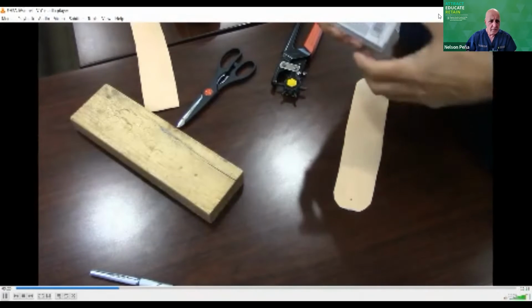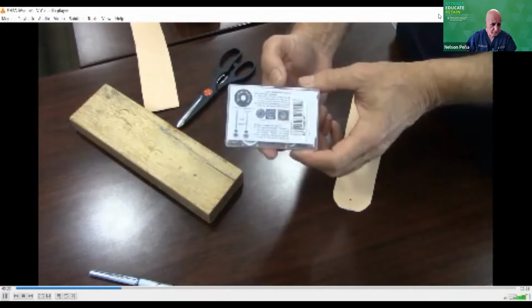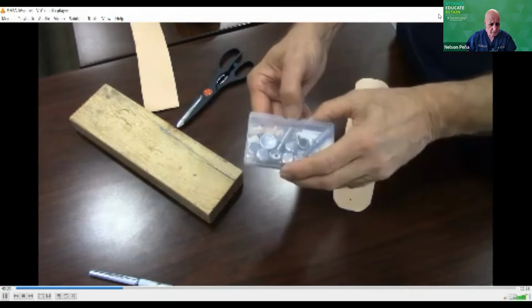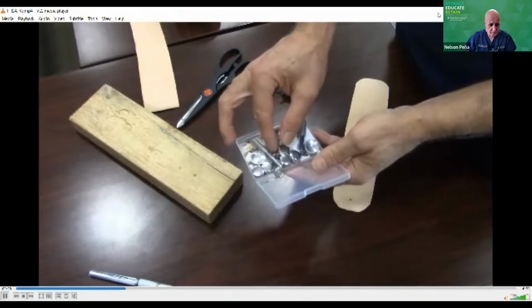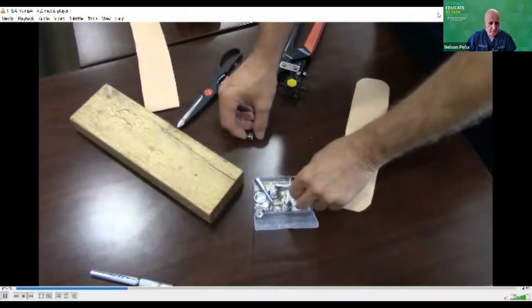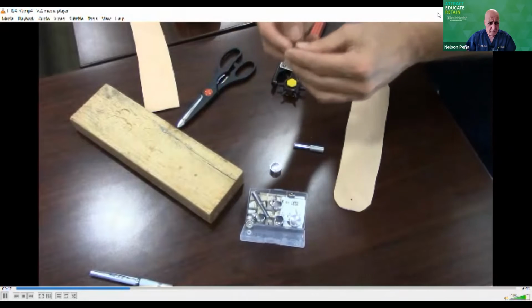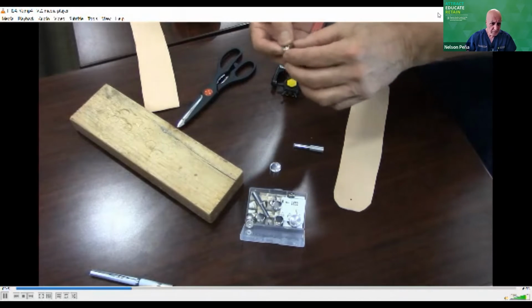Now for putting the snaps in place, I bought this nice little cheap kit, which costs about $7-8 at Amazon, and it comes with the tools that you need to put the snaps in place, plus the snaps themselves. And you can buy extra bags of this for replacements. They come like 100 in a kit, so you get about 25 snaps for each one.